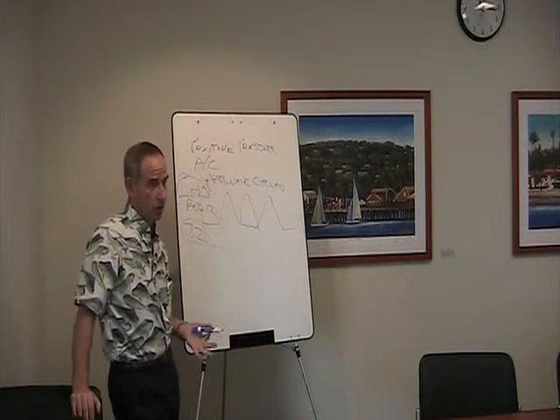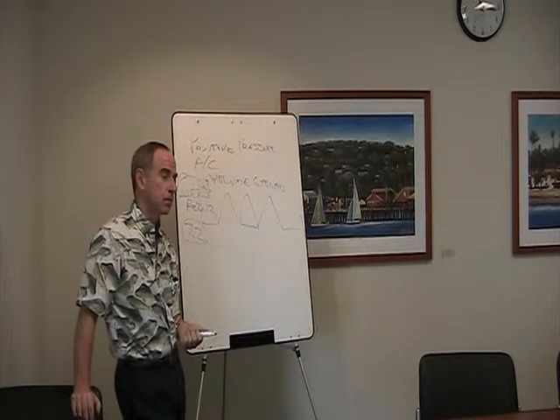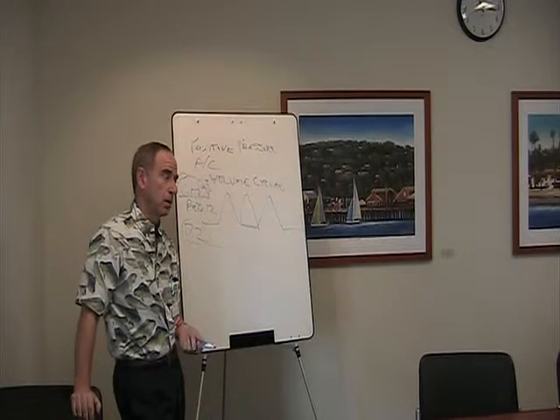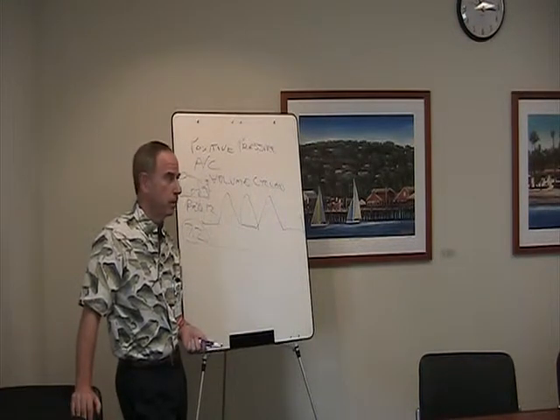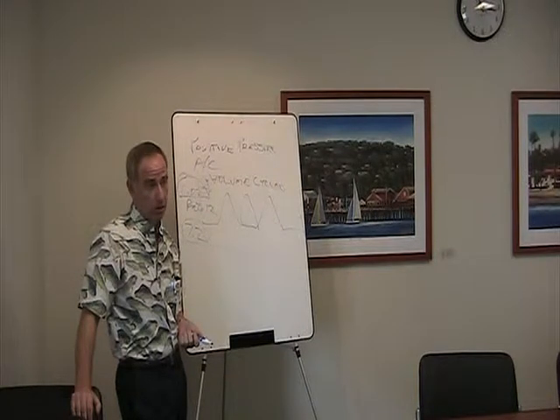So what can you do in that situation? You can switch them over to another mode. What else can you do? You can paralyze them. What else? Short of paralysis, you can reduce the volume, and you can decrease the set rate.